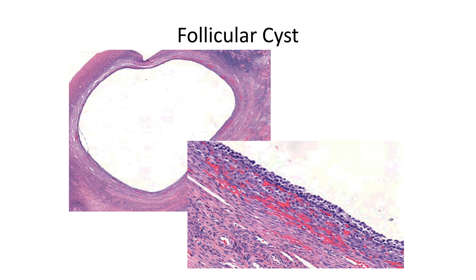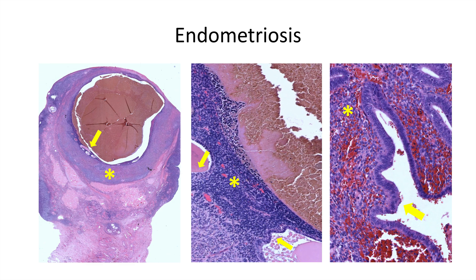Follicular cysts occur most commonly in the reproductive years. They're usually asymptomatic, but they can become large and usually resolve spontaneously. They are lined by follicular cells, usually only a few cell layers thick. Endometriosis is the ectopic location of endometrial glands and stroma outside of the endometrium. On the left is an example of stroma and glands which has formed a cystic mass — the stroma is indicated with an asterisk and the glandular portions with arrows. In the middle image, you can see hemosiderin-laden macrophages surrounding that cystic space full of old blood, with stroma at the asterisk and glands at the arrow. The right image shows similar findings at higher power: endometrial glands and stroma.